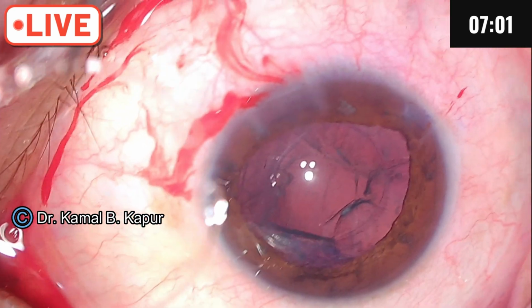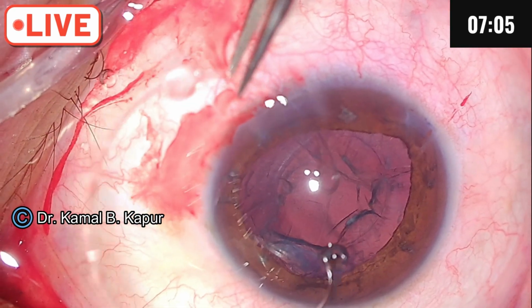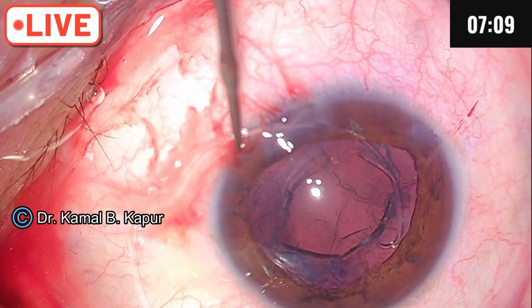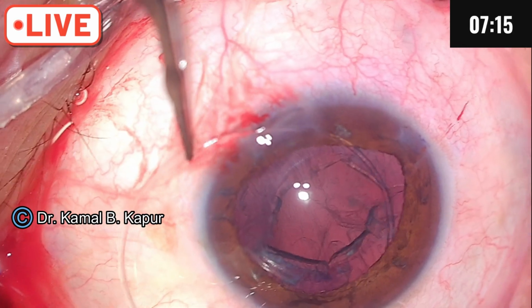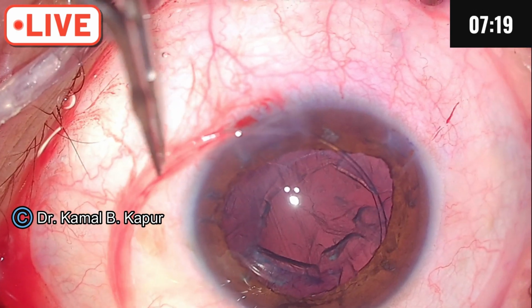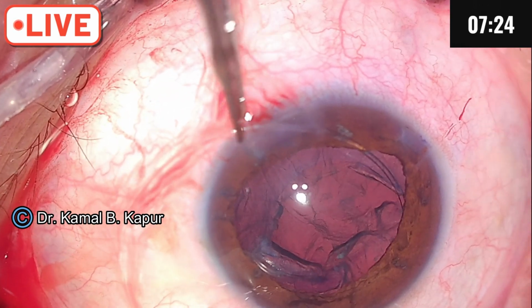center. So we start by pushing the CTR very slowly. The direction of dialing is tangential. These can be very, very tricky situations. It has to be a very controlled dialing.